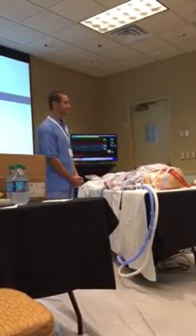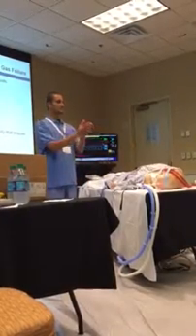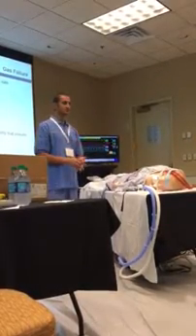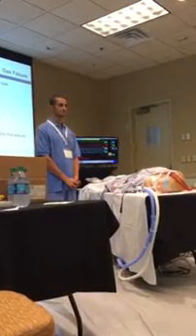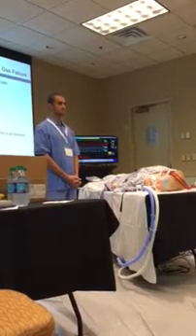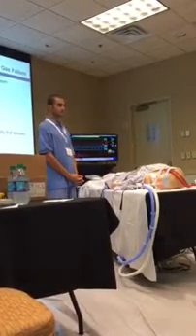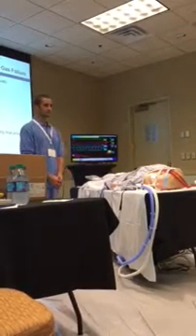All right. Anything else to add, Scott? Gas failure. Actually, we should discuss the circuit check. So how did you pick it up? So your initial circuit check, you missed it? Yes. What did you do differently afterwards? When I was looking, I figured out it was oxygen causing it. You said SpO2 on both, pre and post. Yes, they were both the same, so there was no good color change. So that refocused your efforts to the oxygenator and the gas?